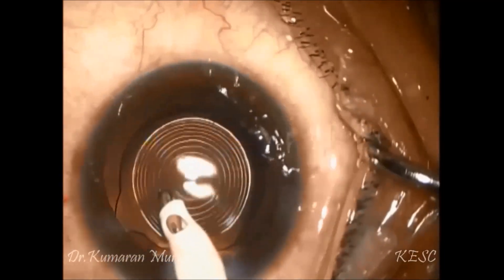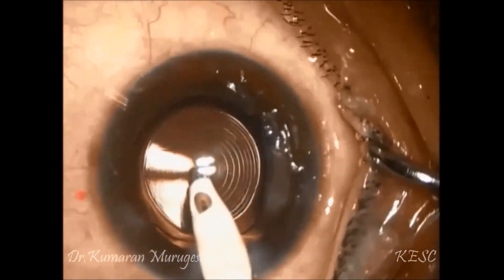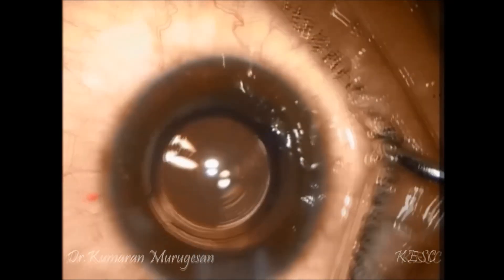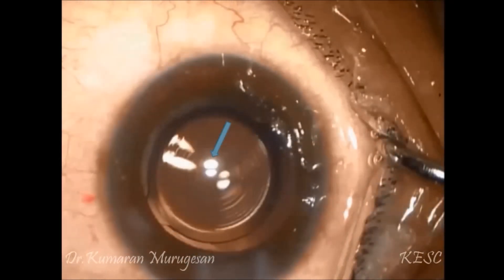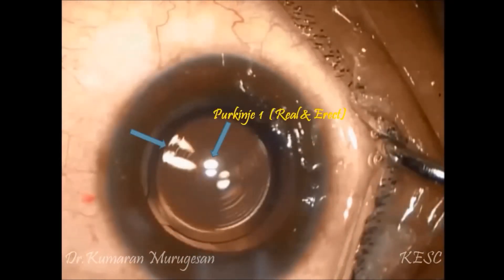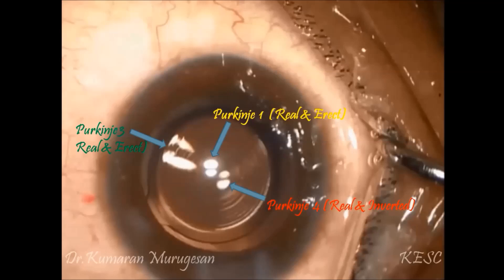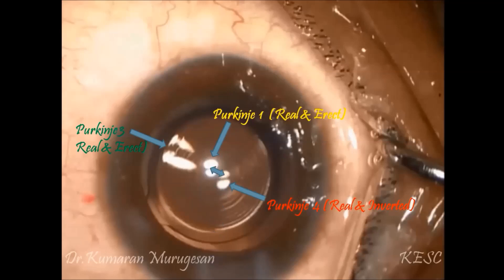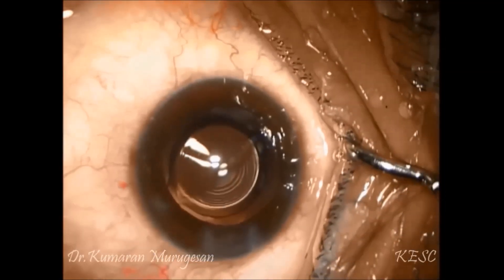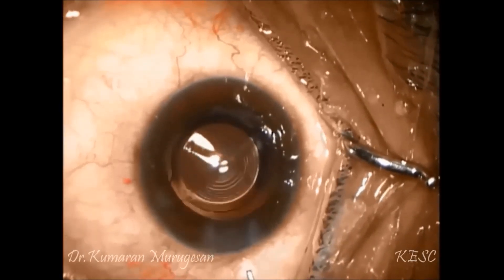We all know that Purkinje image 4 is the only real inverted image. Hence, IOL centration can be achieved by aligning Purkinje image 1 to Purkinje image 4 to the center of the central ring of the presbyopia-correcting IOL.